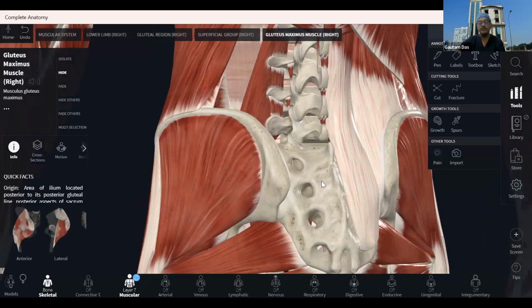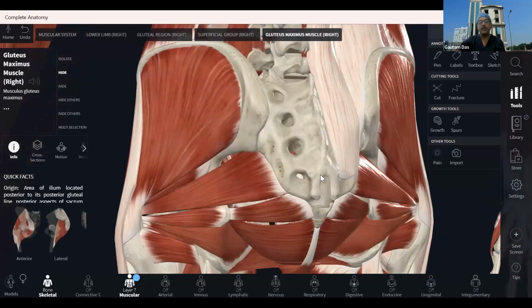for the caudal epidural, we have to find out there is a gap in the medial sacral crest. Coming below the medial sacral crest, there is a gap which is known as the sacral hiatus. So this is one cornu, there is another cornu, and this is covered by a membrane, the sacrococcygeal membrane. So you need to find this sacrococcygeal membrane. You have to pierce it in the long axis to go for the caudal epidural.